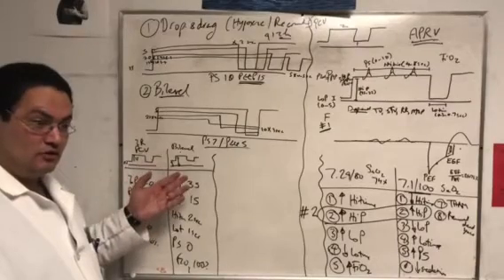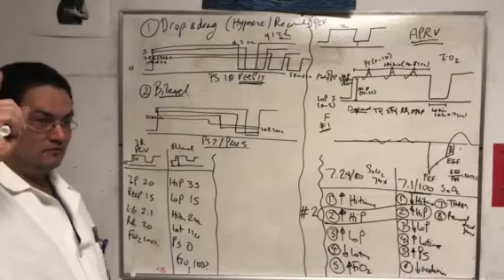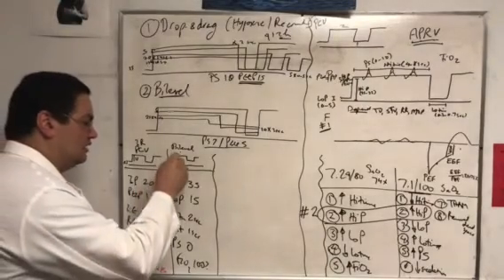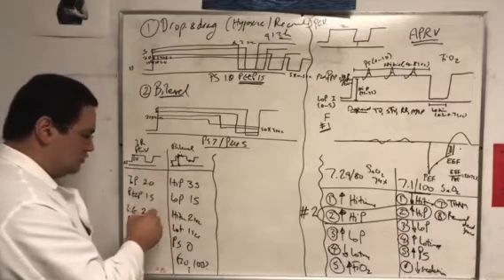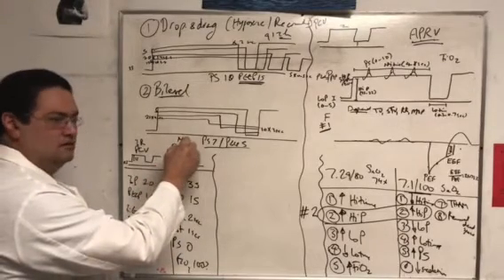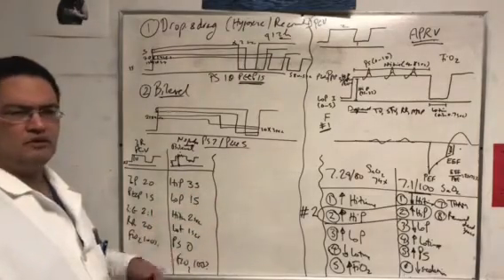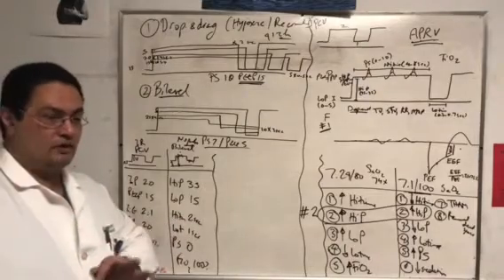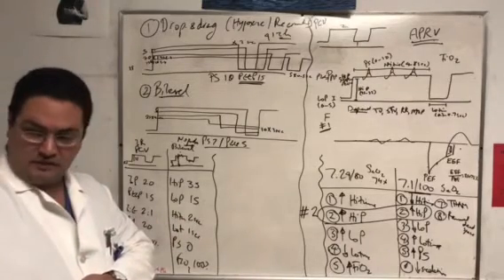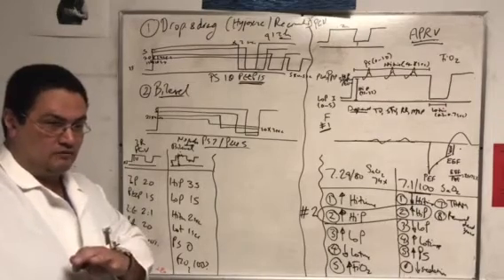Exact mode of ventilation on bilevel, with the advantage that they can breathe on top of this and they can breathe on top of this, and with this inverse ratio they don't need paralysis. Okay, well, somebody can say, oh, paralysis, literature, but literature is now equivocal on paralysis. I love paralysis, by the way. It has its own advantages for at least the first day or whatever. It has its own advantages by itself, not by the mode itself, right?